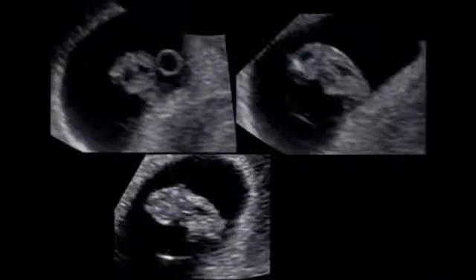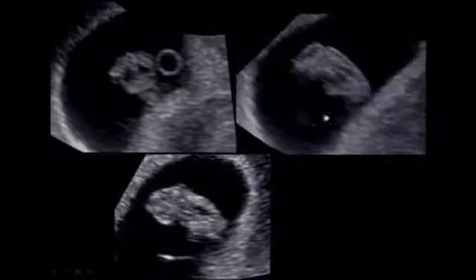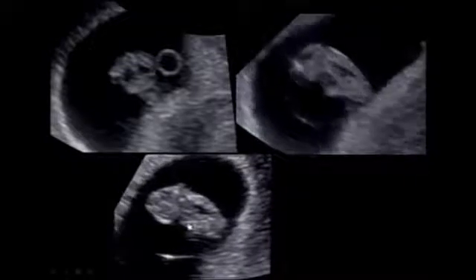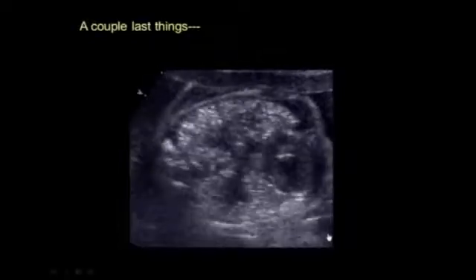Now, we can see these pleural effusions quite early. We can see them in the first trimester, indeed. Here's a yolk sac, and you can see the bilateral pleural effusions in this first trimester embryo. You can see the sagittal view of the effusion here. And this is certainly not a good sign when you see pleural effusions at 10 weeks. If you notice also, the cardiac activity is very irregular and bradycardic, and this embryo did not survive.